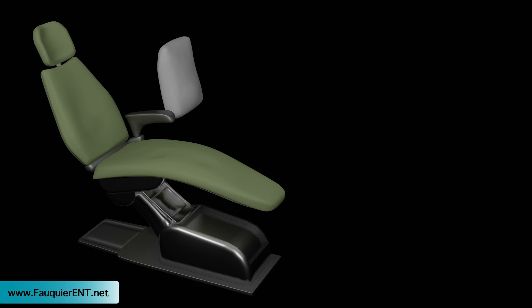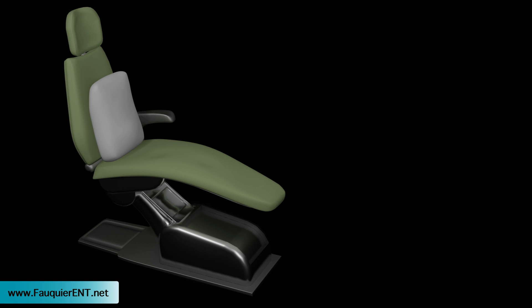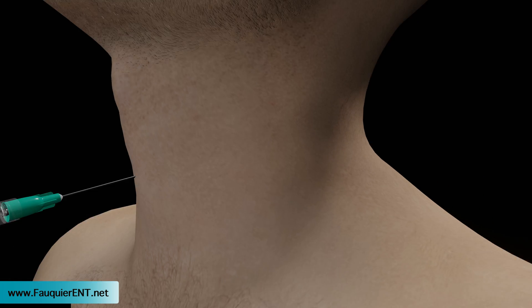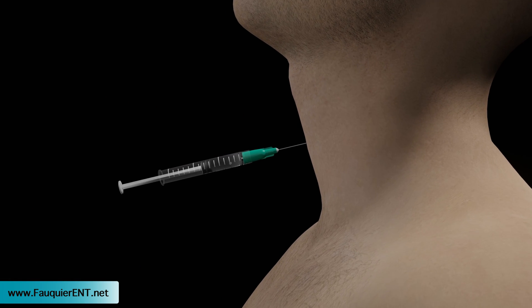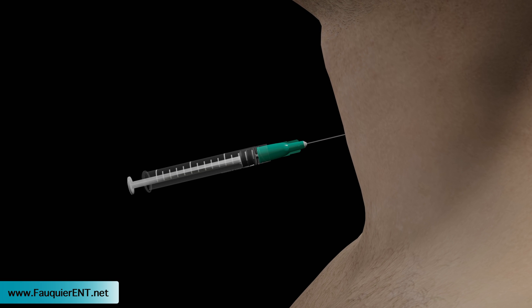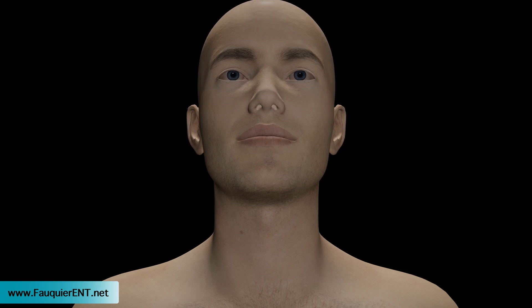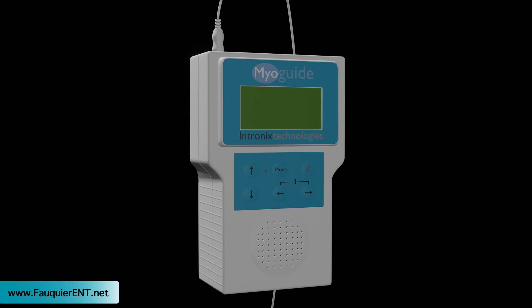The patient is positioned seated comfortably with the head hyperextended. An injection of lidocaine is administered into the subglottic space via the cricothyroid space, located just below the voice box. Over the next few minutes, the local anesthetic will numb the voice box, making the subsequent botulinum toxin injection much easier to tolerate for patients.